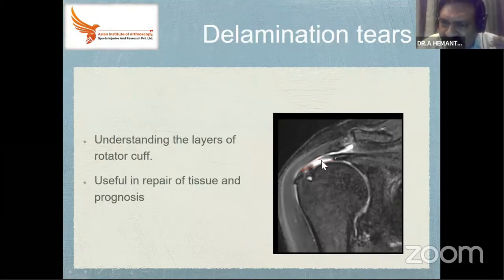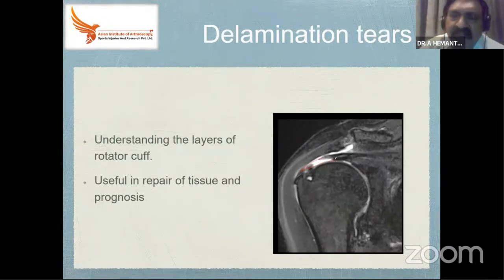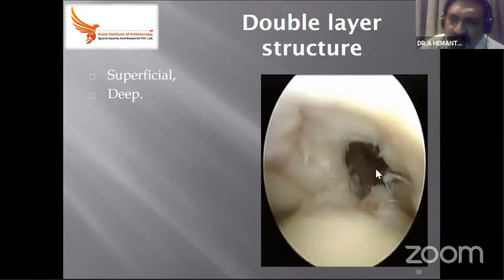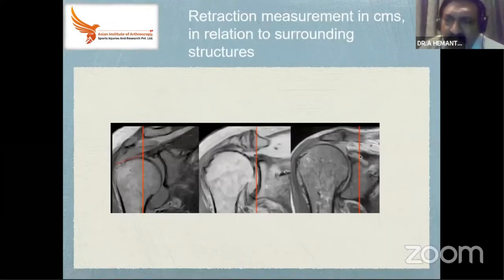In reality, this is how a delamination tear looks in arthroscopy — you can see the superficial layer and the deep layer. When communicating a cuff tear to colleagues, you should measure it in centimeters anterior-to-posterior and medial-to-lateral. Use landmarks such as the acromioclavicular joint, the tip of the acromion, and beyond the AC joint.